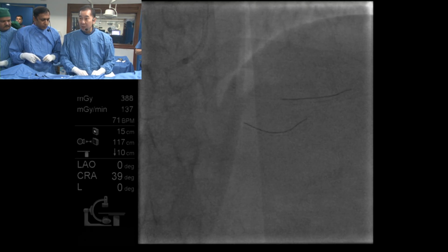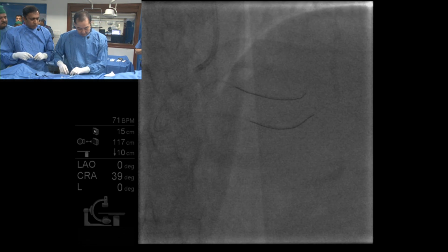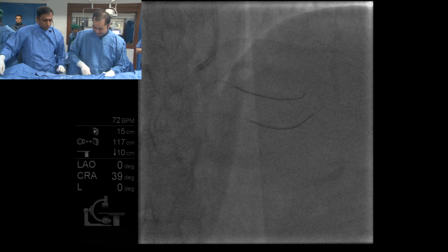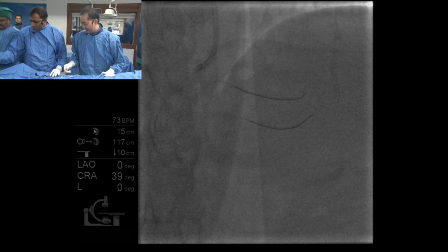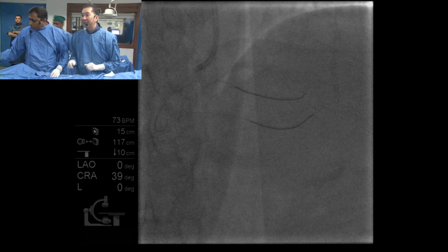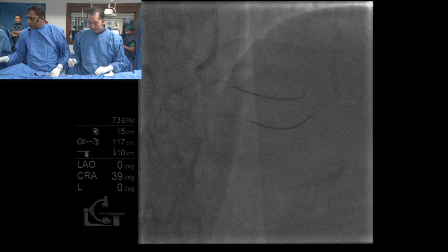So you guys think OCT is okay in this case, or do you all like IVUS? Or no imaging guidance? Image guidance of some kind I would vote for. I don't have a preference myself, but I'll take other comments. Yeah, me too. I think this case may be okay for OCT.